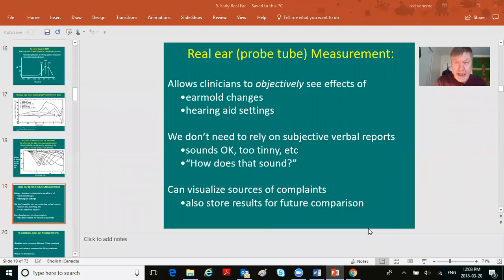But either way, at least you're getting something with numbers, something on a piece of paper that you can copy one way or the other. I mean, this is the issue. This is the thing that we want to separate OTC grads from the herd: do real ear. When you're not using real ear, you are not elevating the profession to its next rung. The idea is to raise the bar of this profession and to make yourselves scientists as well as artists. Instead of sitting there painting fingernails, let's measure what's really going on.